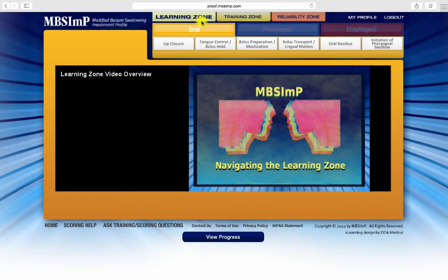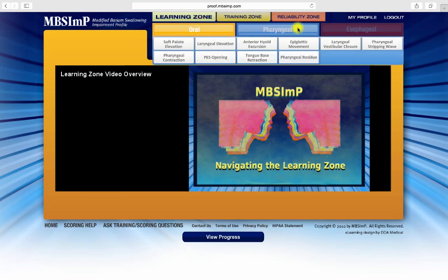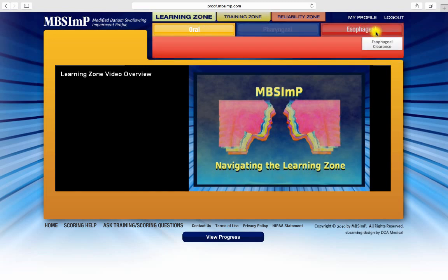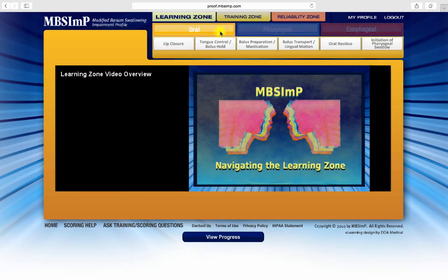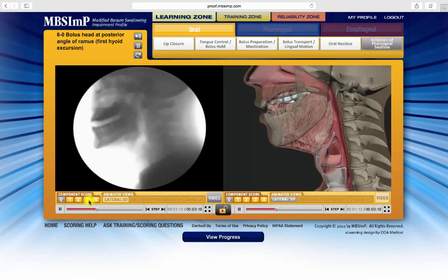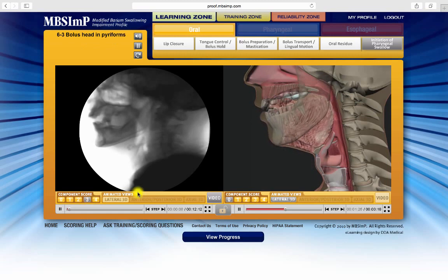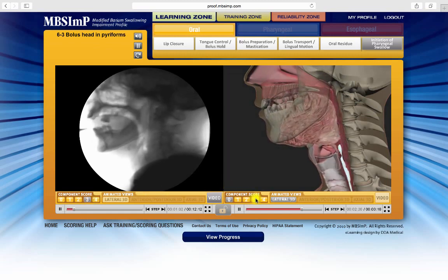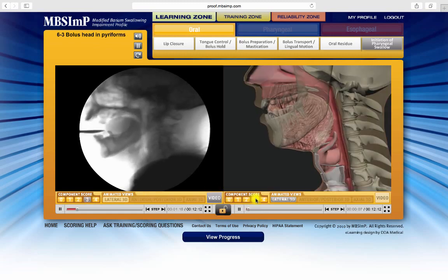All new users will begin at the Learning Zone. Organized by the three physiologic domains, the 17 components are categorized under either the oral, pharyngeal, or esophageal domain. The scores for each component are explained and demonstrated using representative segments of video fluoroscopy, paired with detailed and synchronized animation.